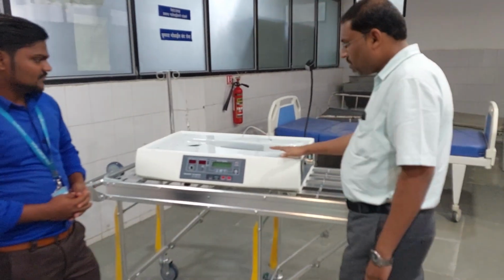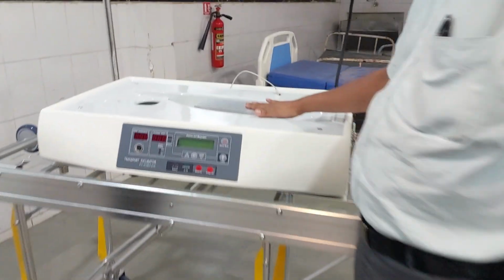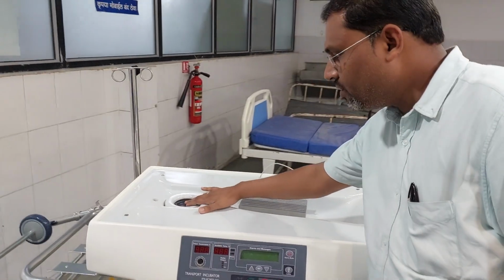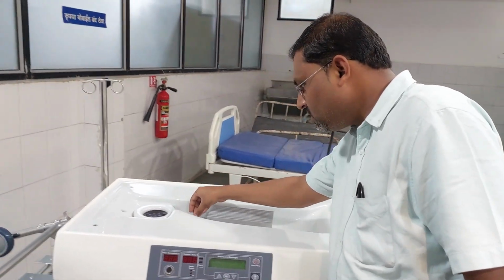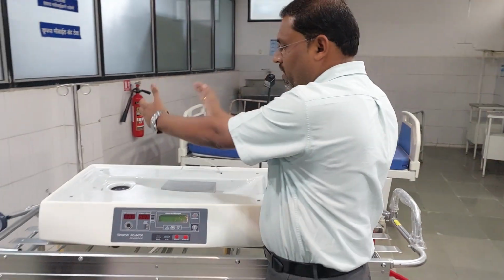Now see, this is the base of the incubator which they have provided. Come close. This is the heater assembly. This is the fan. With the help of the fan, the air is released and passed through the heater, where it gets heated, and that is passed towards the baby.